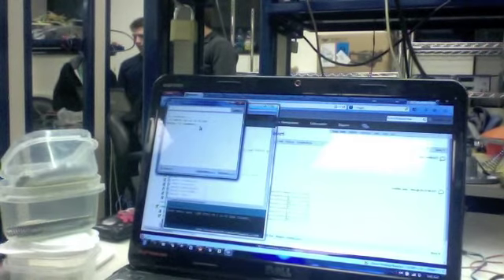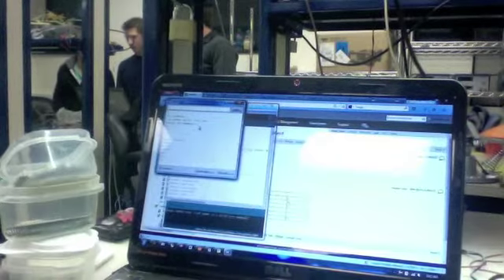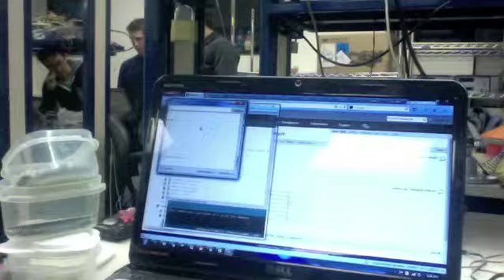If you're ready to activate cooling, then you can hit the A key, and it will start sending you its data.